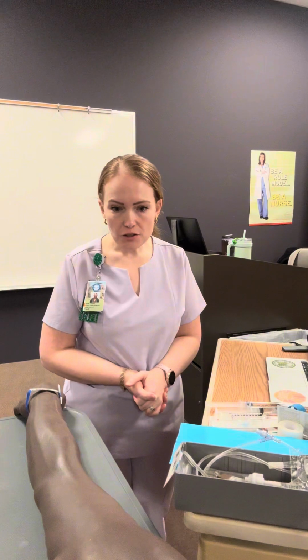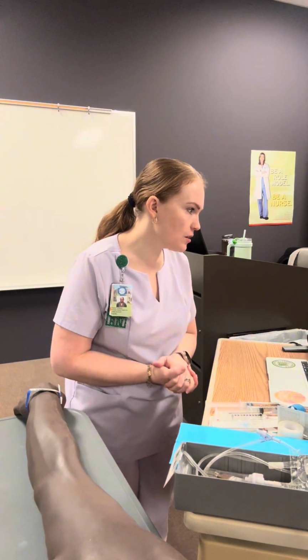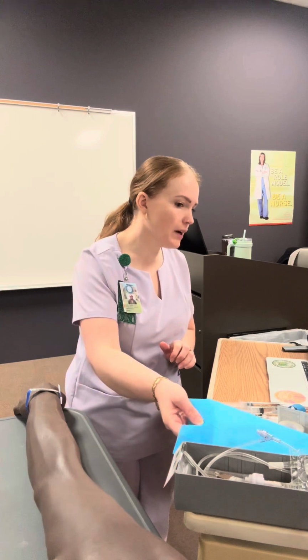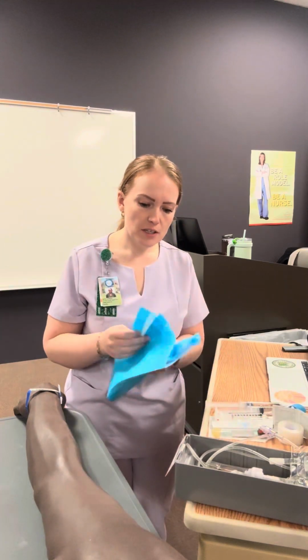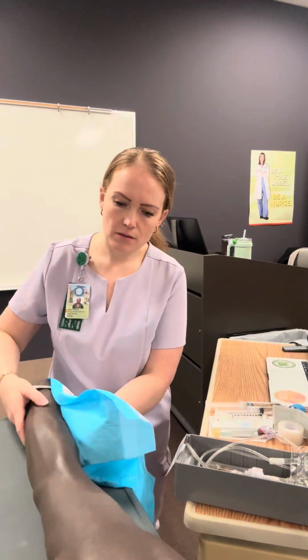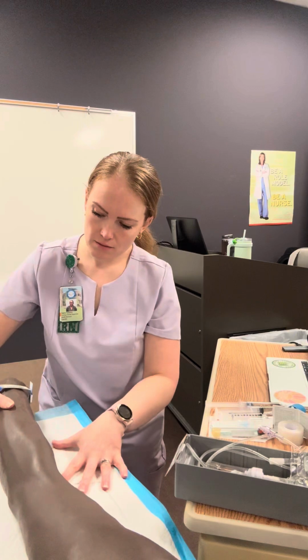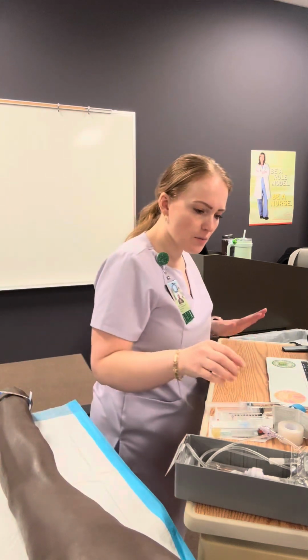Do you have any allergies? Okay, she said no. I'm going to double check here and make sure there are no allergies on the chart. Okay, so I'm going to place this protective pad under your arm just so that we don't get any mess anywhere. I'm going to be working over here to get some things prepared.